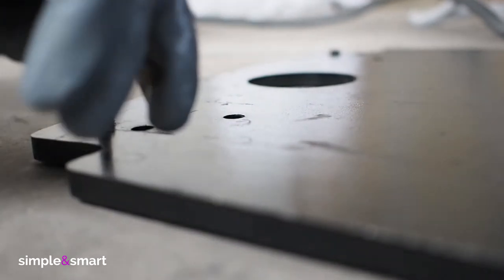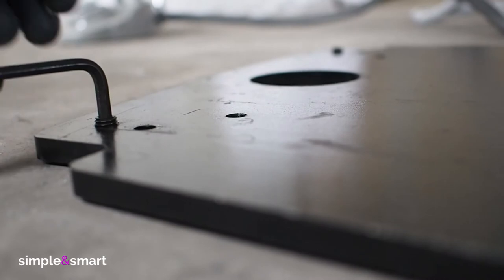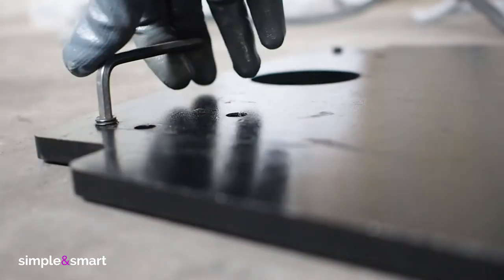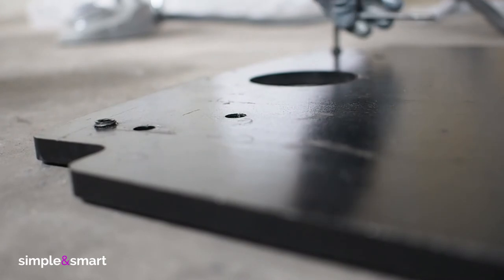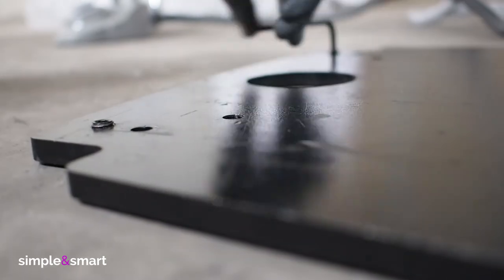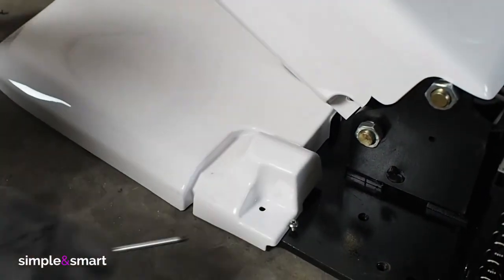You can now adjust the chair base just working on the regulator screws on the base. This operation must be done if the floor surface is not regular. This operation will permit to stabilize the chair and avoid shaking or incorrect balance of the instrument arm. Place back the plastic cover and lock it with its screws.